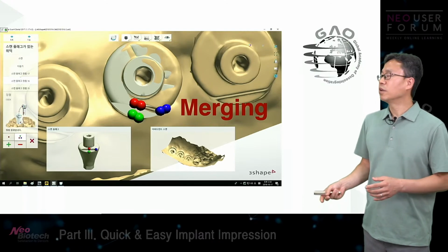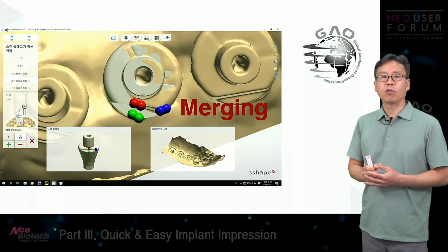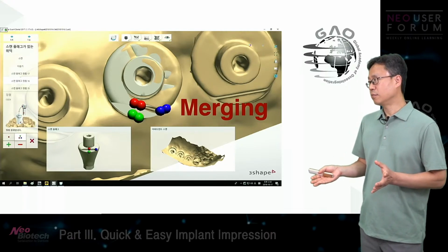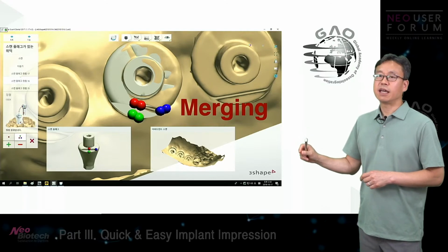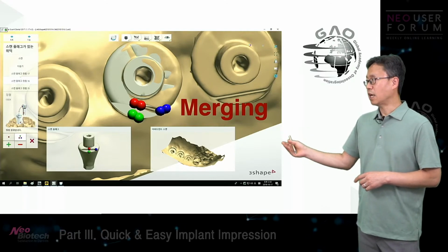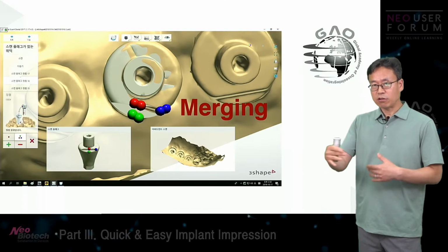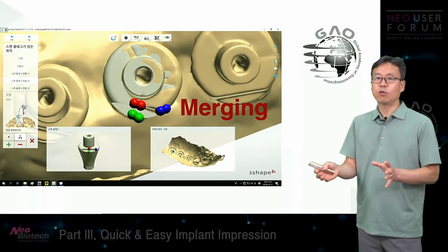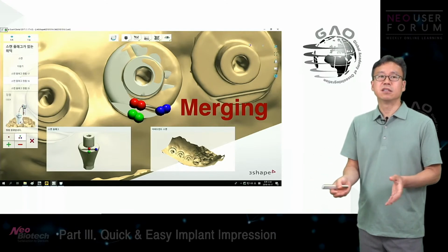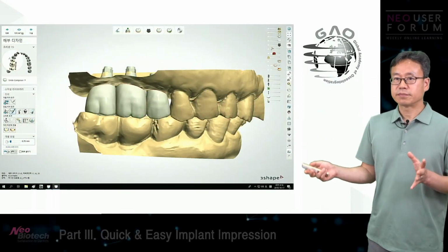I believe merging might be the one most important word in terms of CAD/CAM dentistry. It's like, I would say, proofreading. After you write reports, you try to proofread it, see if you wrote well or wrote what's right. Let me show you an example of this merging.